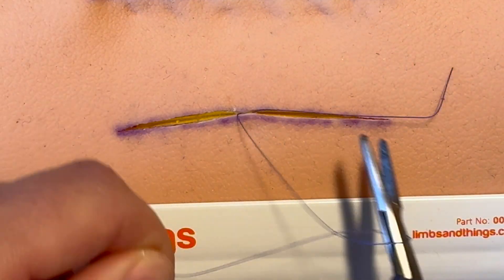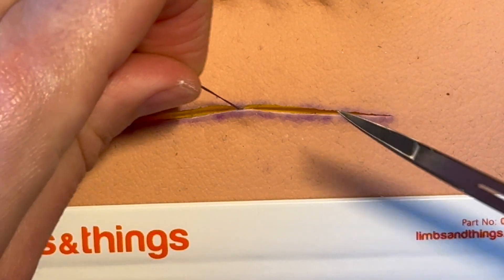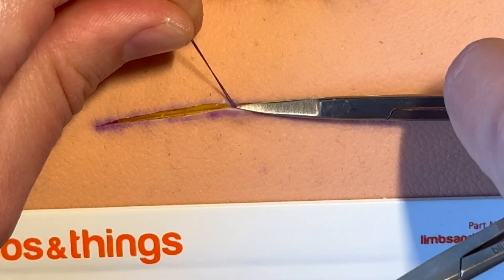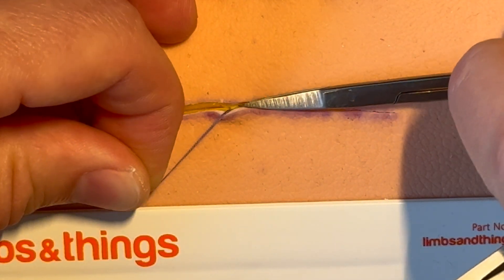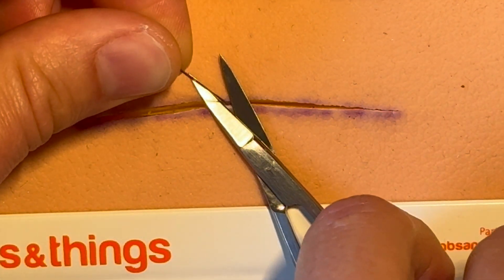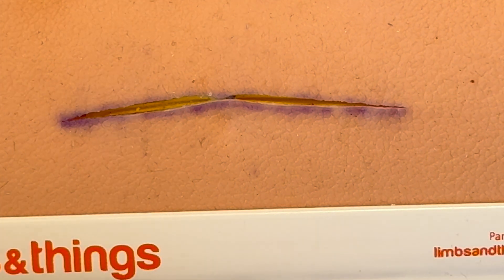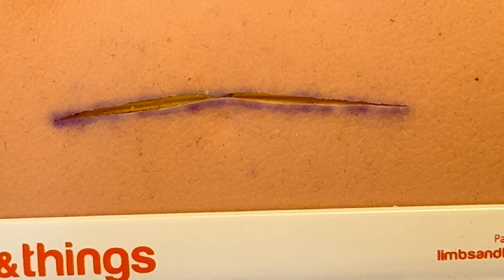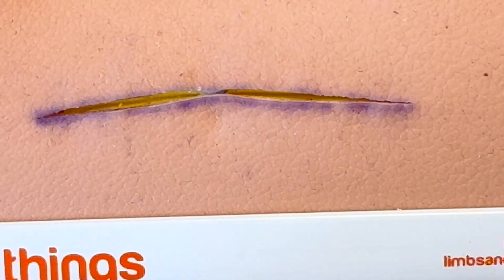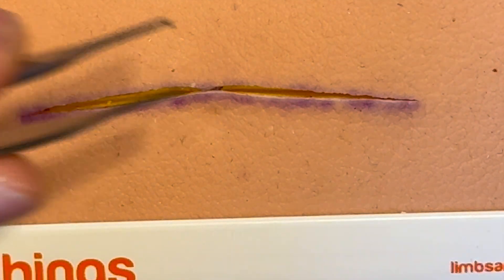Pull it through and finish off as normal — we've got a pretty reasonable result, probably a bit better in a human. Snip that off flush to the skin. If you've done it correctly, that knot should be quite deep and well below the surface of the skin, so you're safe to cut it off at the surface. Ask the assistant to put the scissors on the skin surface and snip it there — it might be slightly poking up but should normally spring back nice and deep.